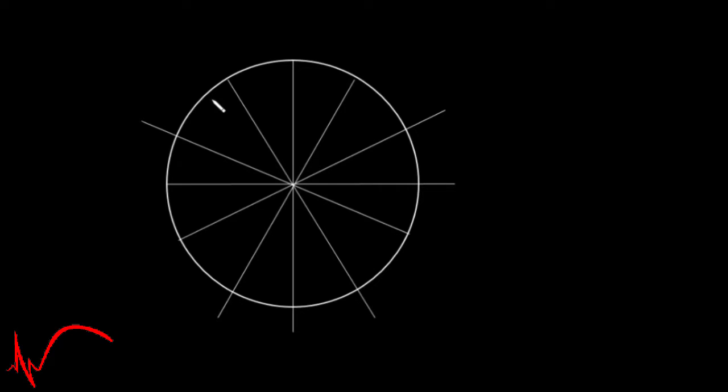When you combine the vectors that they comprise of, you get this circular diagram. Now we quantify the cardiac axis in degrees, and each of these lines on this diagram is assigned a value. They also represent a lead from one of the 2 sets that we've discussed.